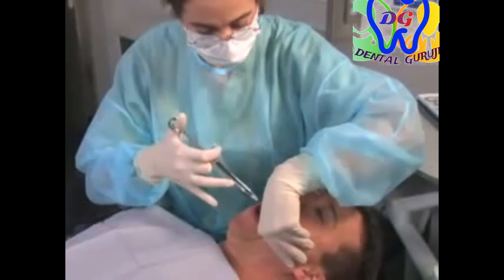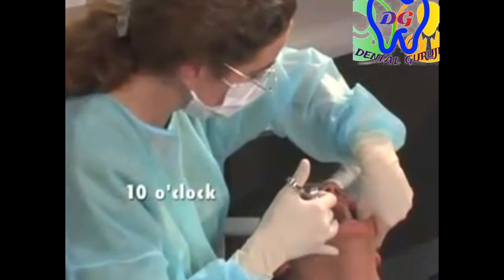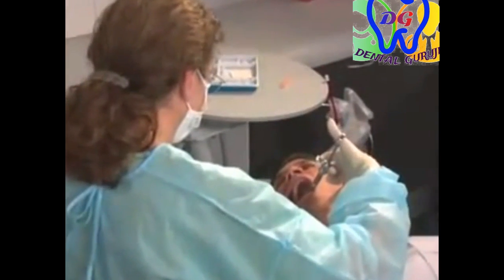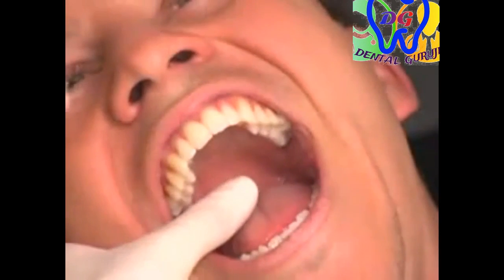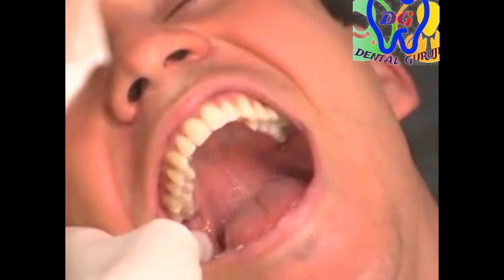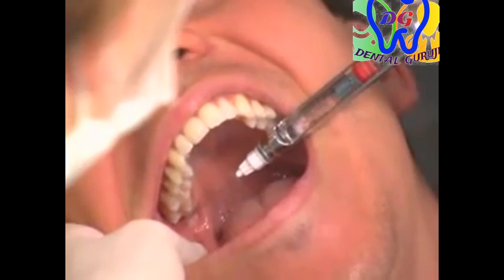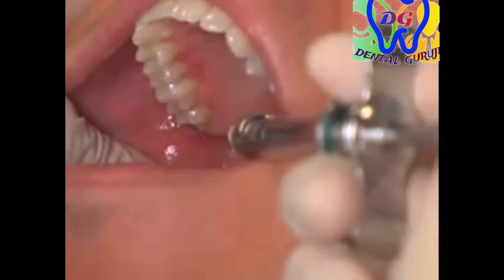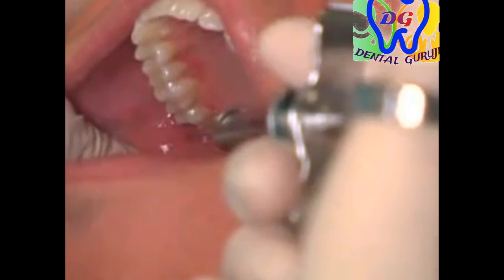For the left Gow-Gates mandibular block, the right-handed operator should sit in the 10 o'clock position facing in the same direction as the patient. For a right Gow-Gates mandibular block, the right-handed operator should sit in the 8 o'clock position facing the patient. The coronoid notch is palpated. The barrel of the syringe is placed in the corner of the mouth on the opposite side, and the needle tip is placed just below the mesial lingual cusp of the maxillary second molar, then moved just distal to the second molar. This locates the insertion site for the Gow-Gates injection.